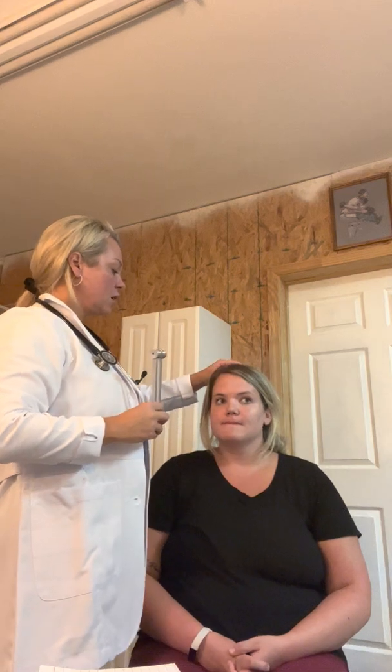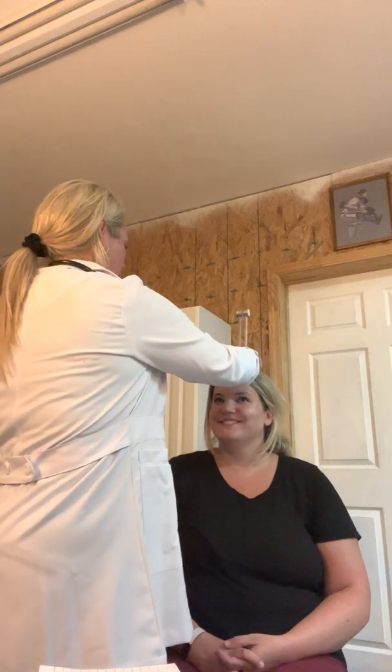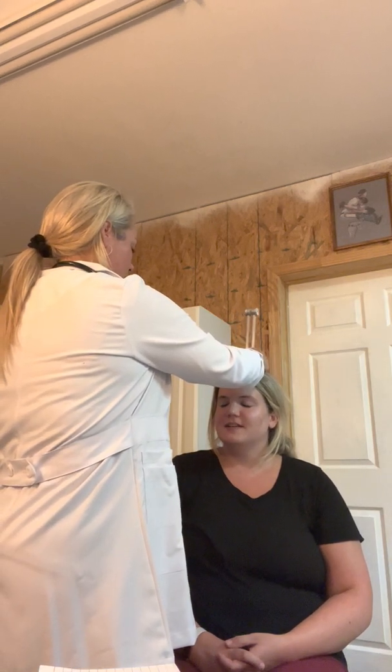I'm now going to use a tuning fork, and I'm going to do the Weber test, where I'm going to strike a tuning fork and then stick it on the middle of her head. Melissa, I want you to tell me if you hear the vibration the same in both ears or if one ear is different, okay? It's the same. So this is the Weber test, and what that means, she hears it the same in both ears, so there's no lateralization. So hearing is equal on both sides.